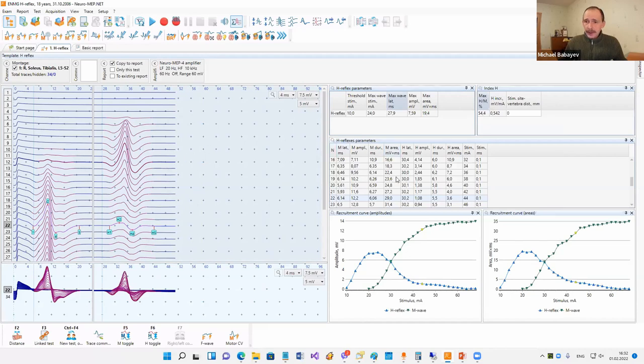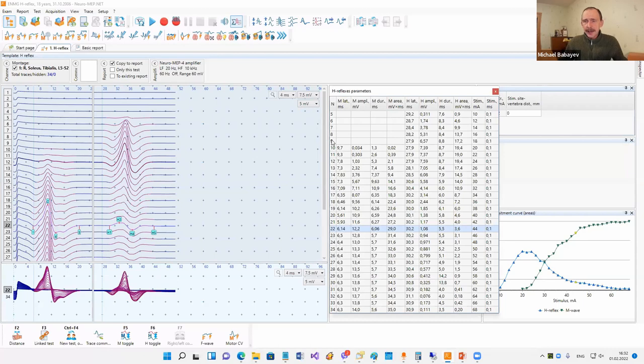The same can be done with a table. For example, here is a table with scroll bars, but if I click this button I can see the full table. Moreover, the font in this table is larger.